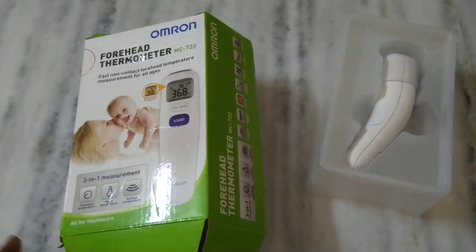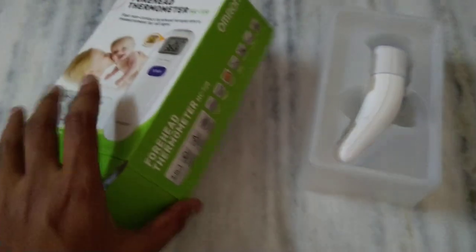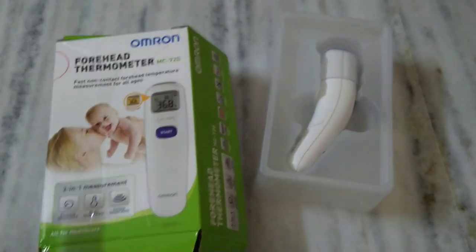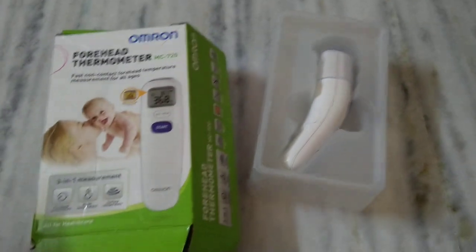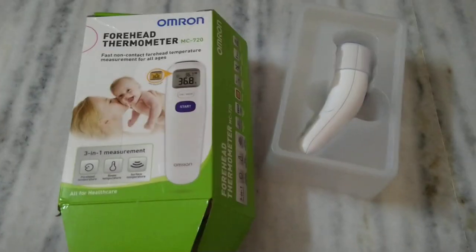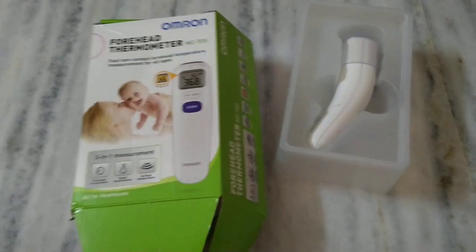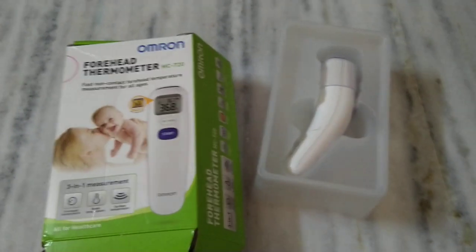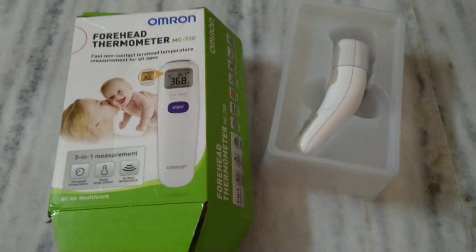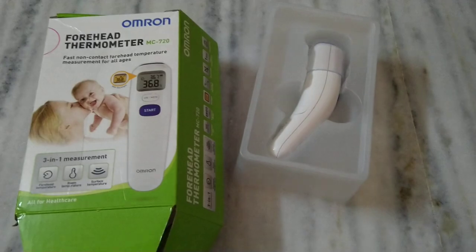Hello and welcome to SVM Cars and Bikes. Today I'm going to show you this contactless temperature monitor, which will be very useful for small kids. Nowadays with contact temperature monitors you have to wait for two minutes to get a reading, so if a child is suffering from fever they can't wait two minutes to check temperature.